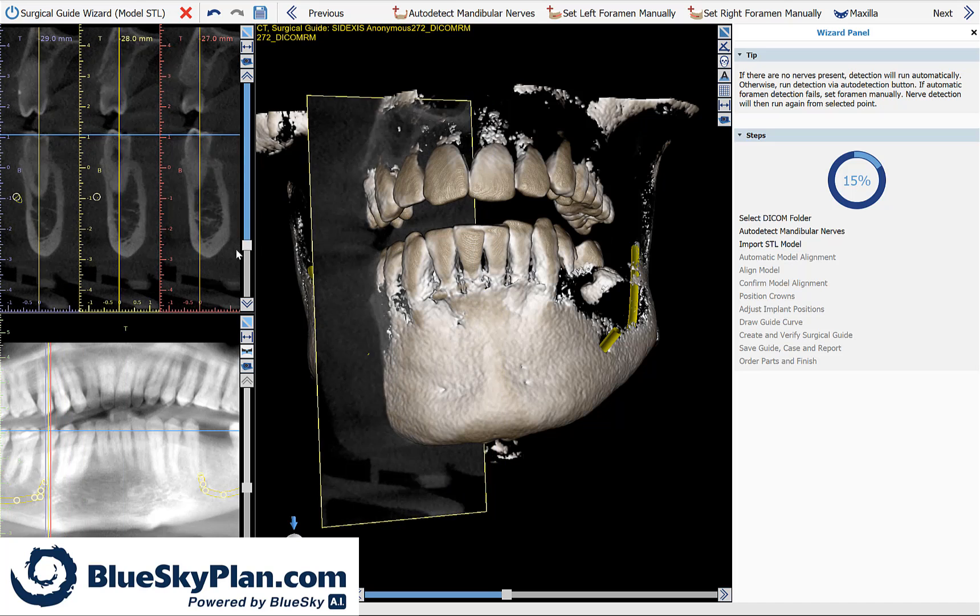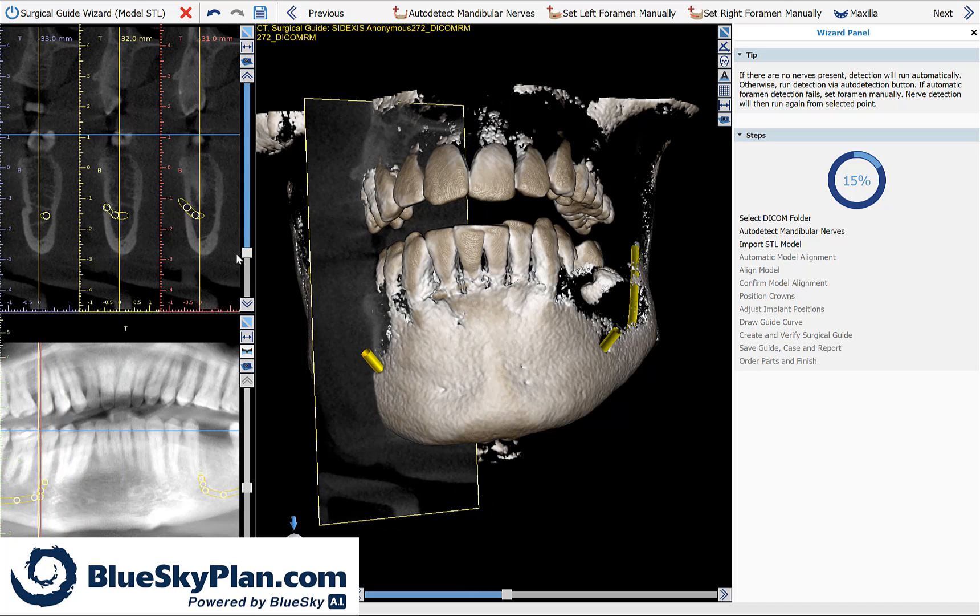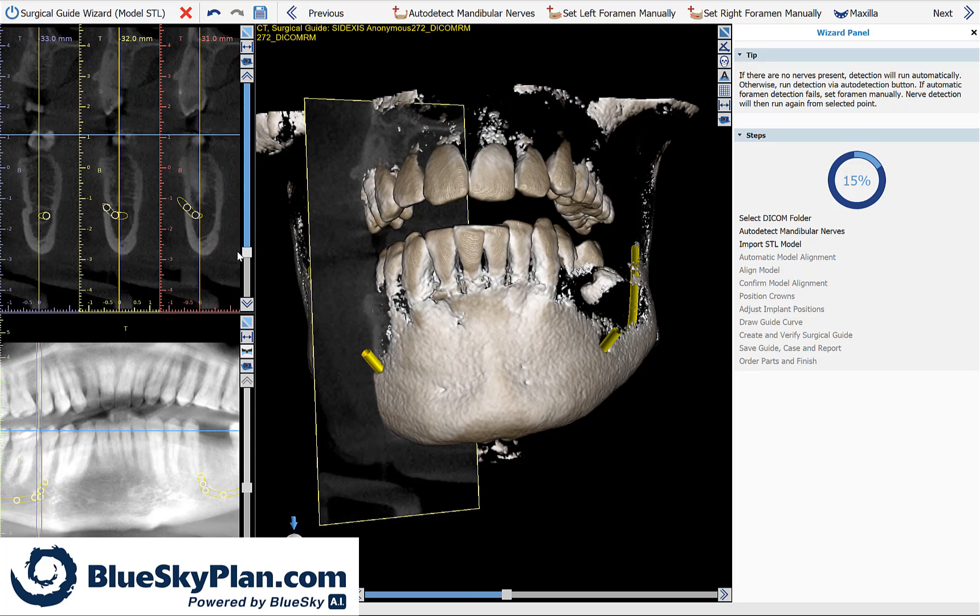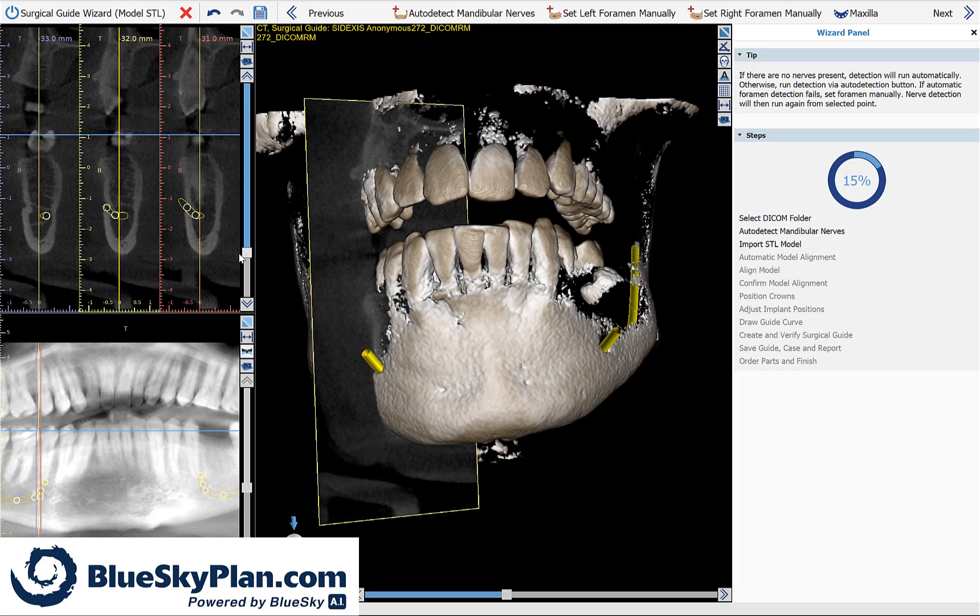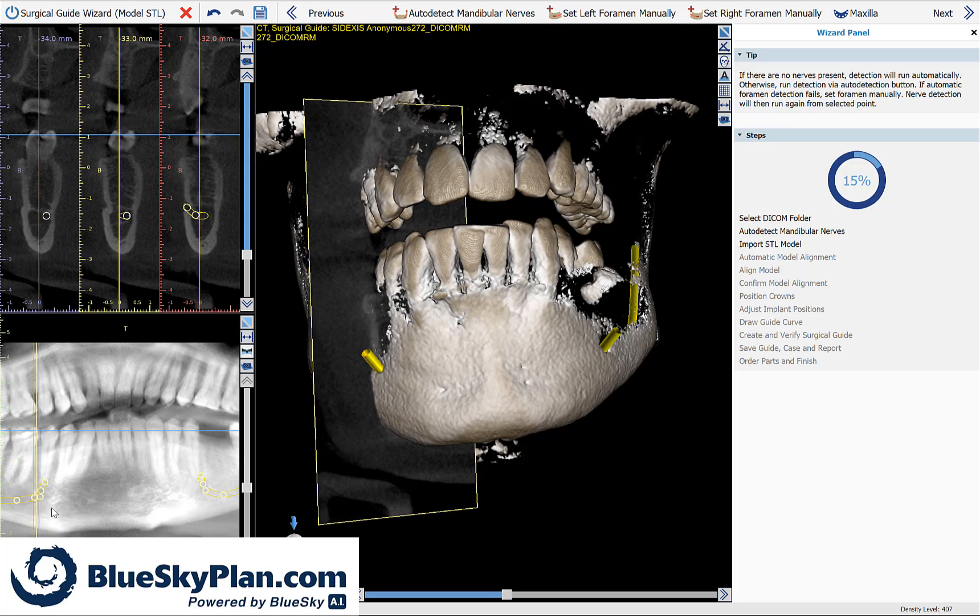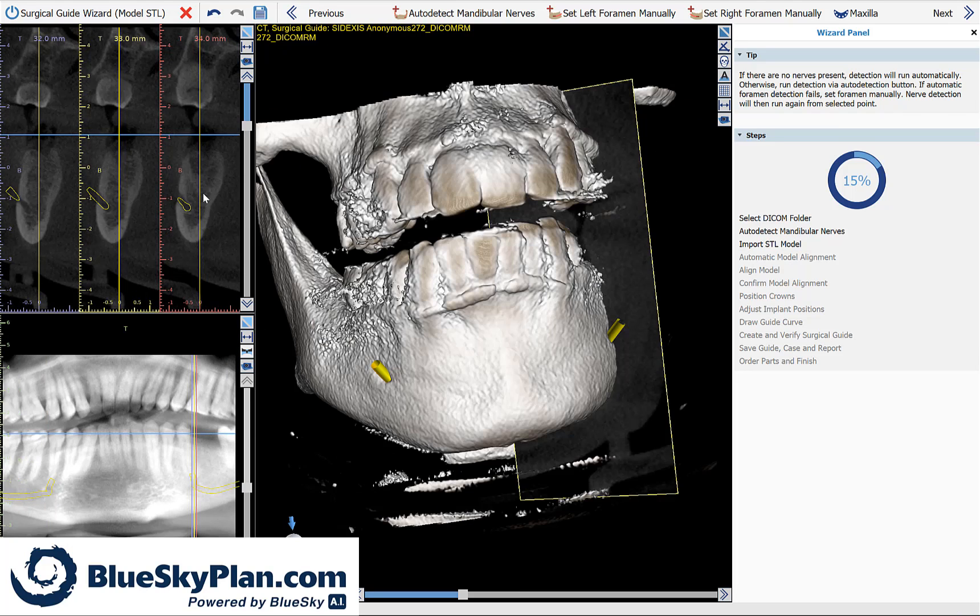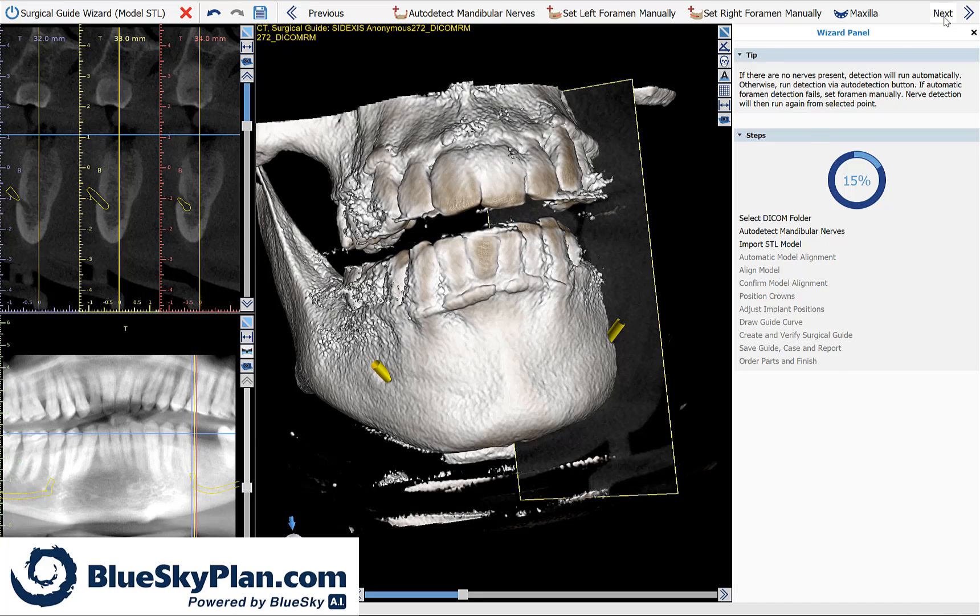This happened completely automatically by the software. If you want to fine-tune the placement of any of the nerves, simply grab the nodes in the 2D views and use your left mouse button to grab and drag them. Once you have confirmed the nerve placement, simply click on Next.